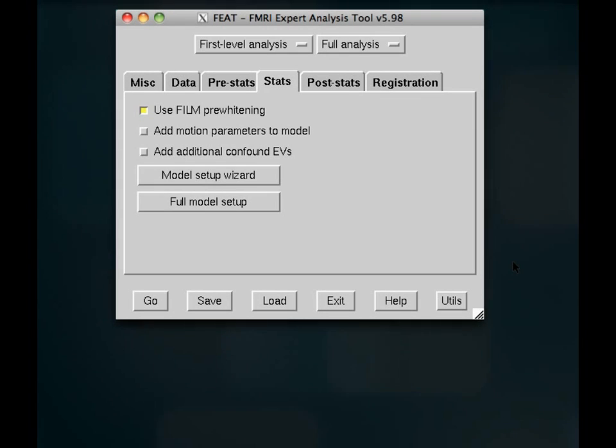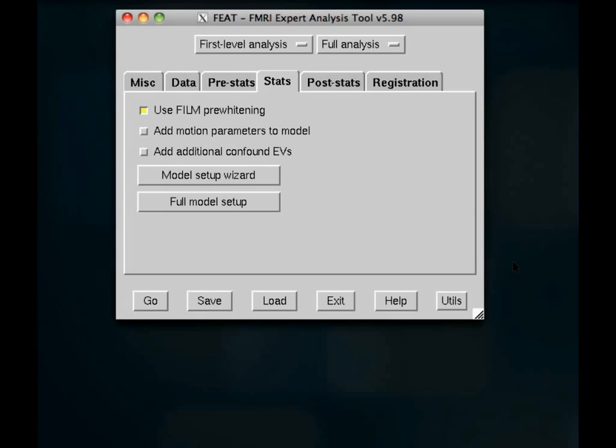Today we are going to be talking about the Stats tab in FEAT, which allows you to set up a model that you can then use at each voxel in your data set. We'll also be covering how your timing files should be set up so that they can be read into FEAT.